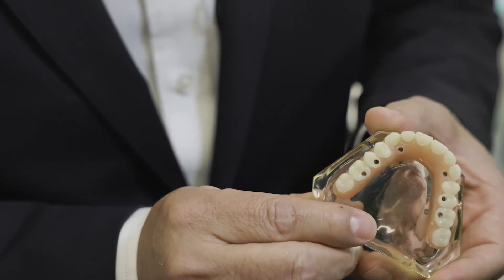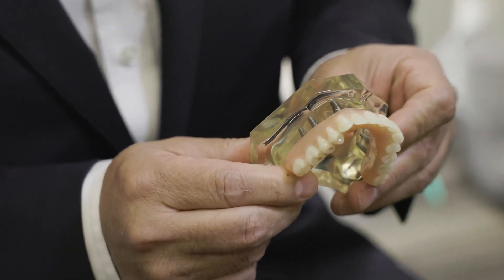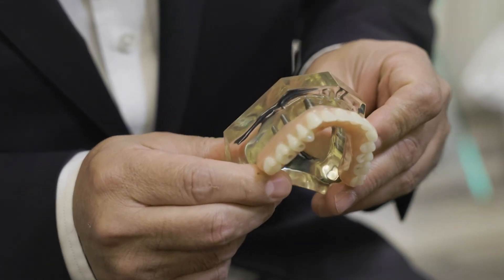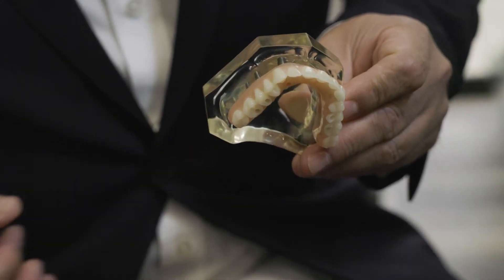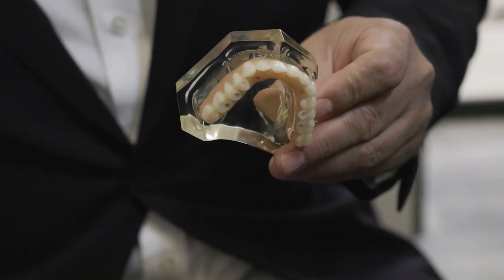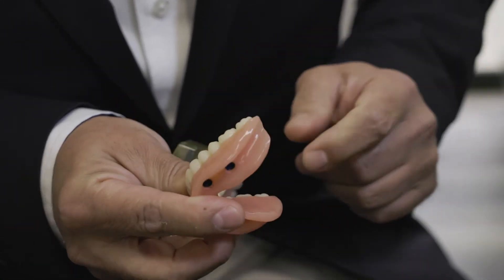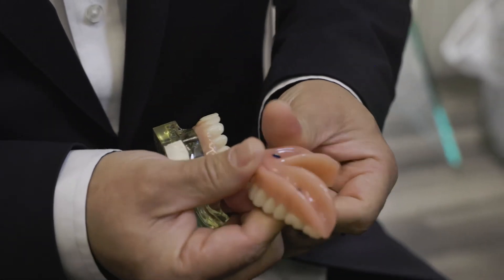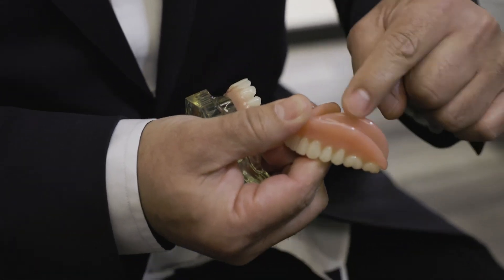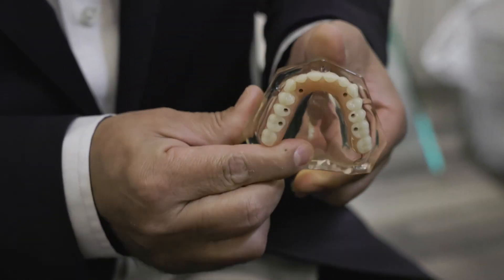I want to bring up one other difference between this and our snap-on teeth — it's a much smaller prosthesis. With a denture, we have something known as a flange, and this area here is a flange. You'll notice that we don't incorporate a flange with the All-On-X type bridge — we don't have a need for it.